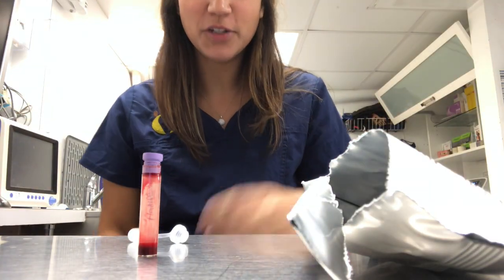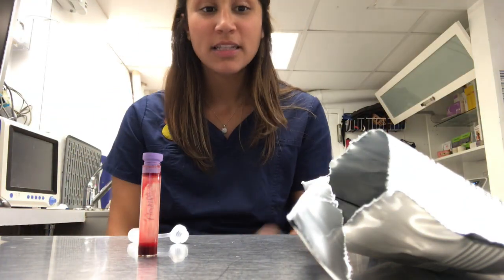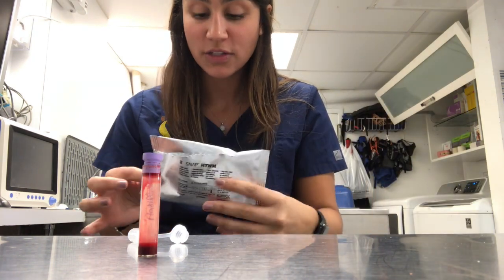Today I will be showing you how to do an ELISA snap test in-house. Today I'm going to be doing a heartworm test. This heartworm test tests for the antigen that female heartworms actually give off in the dog's bloodstream.